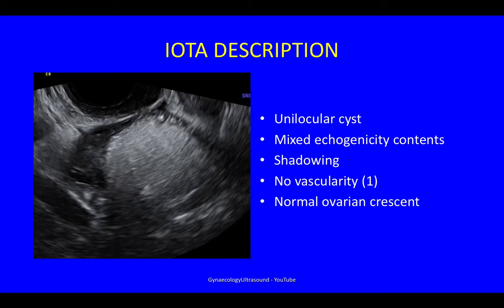Let's go through it and describe it using IOTA terminology to begin with. This is a unilocular cyst with mixed echogenicity contents, shadowing, no vascularity, and a normal ovarian crescent.